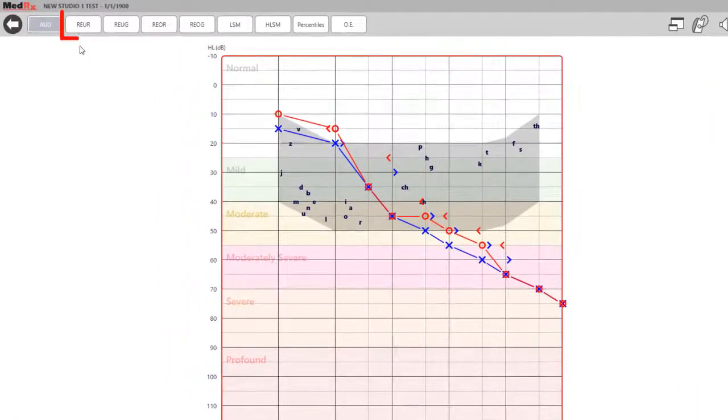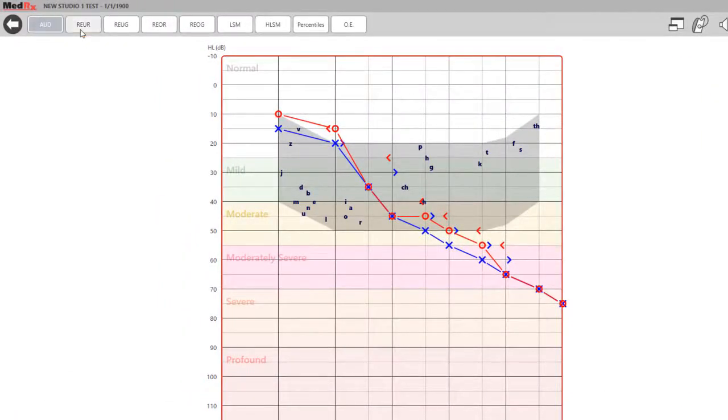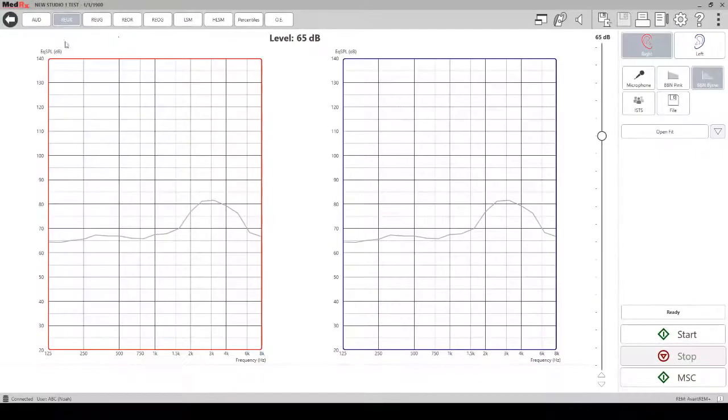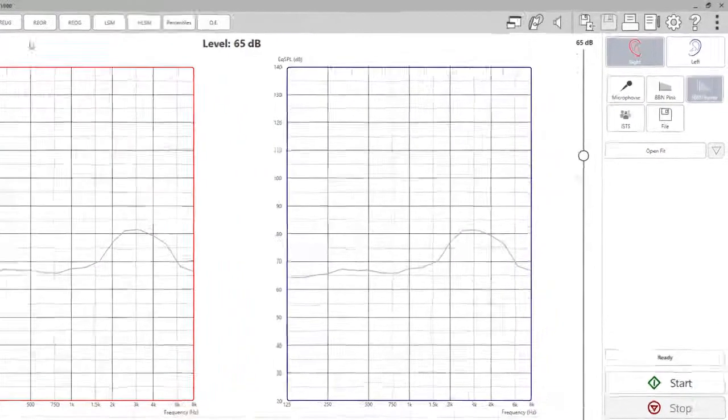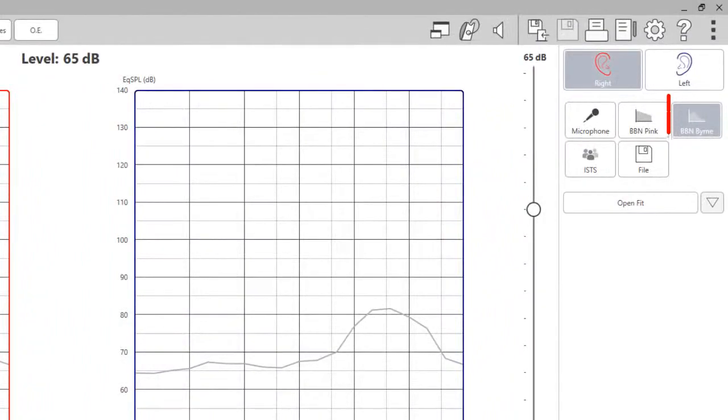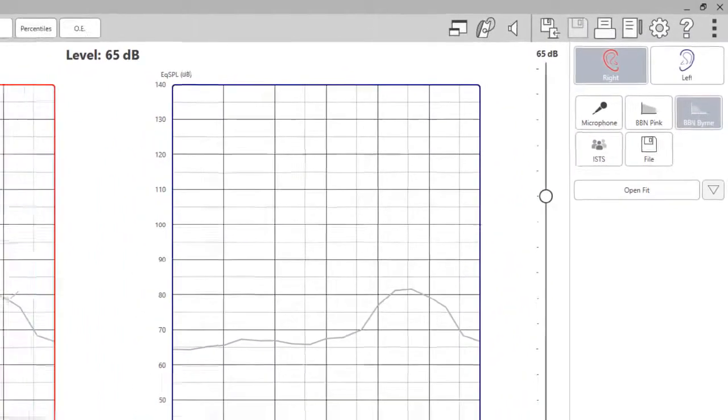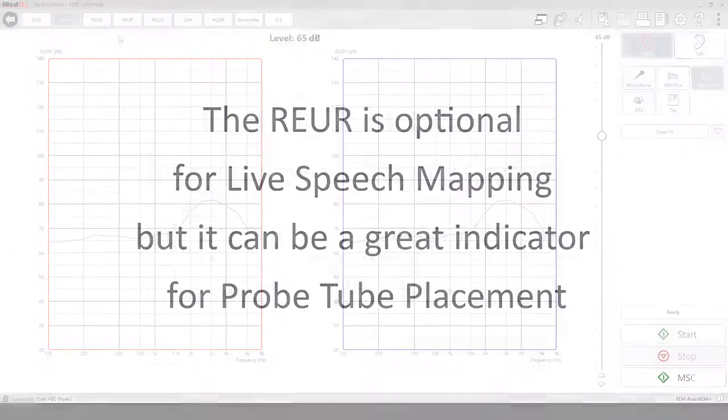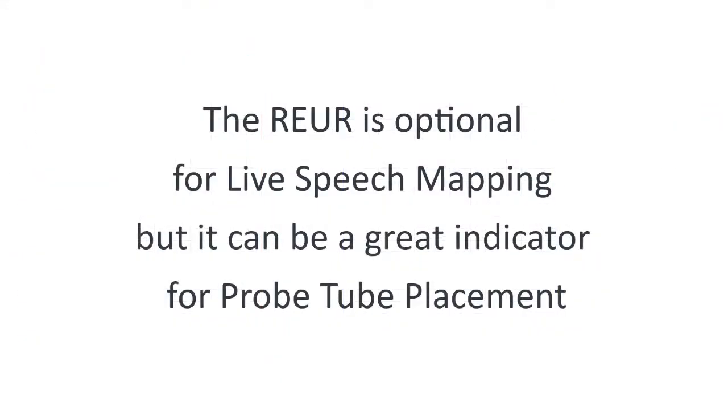To run a real ear unaided response, click on the REUR tab at the top of the screen. A broadband noise burn signal should be used for this test. The REUR is optional for live speech mapping but it can be a great indicator for probe tube placement.